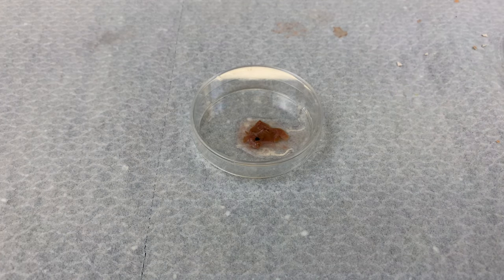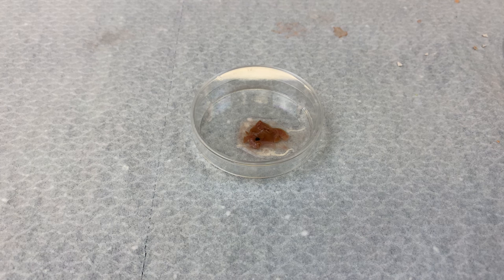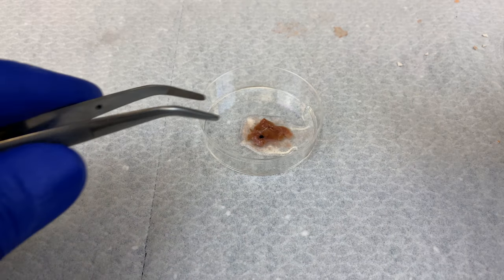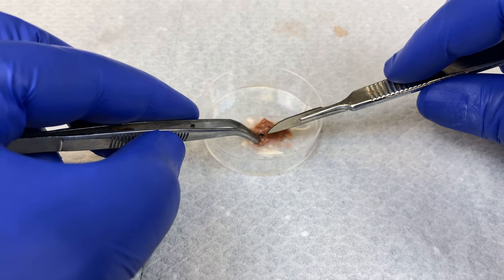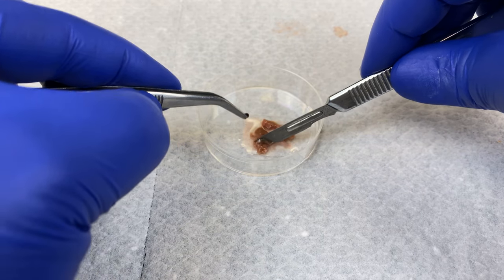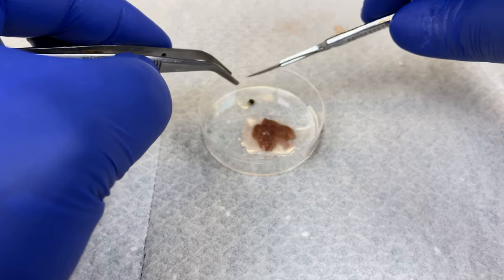While we're waiting for our explant and our cold trypsin to incubate, I will demonstrate the mechanical disaggregation method. This method is best used on soft tissues, such as the liver or the brain. I will remove this gallbladder and place it off to the side — we'll come back to that later.